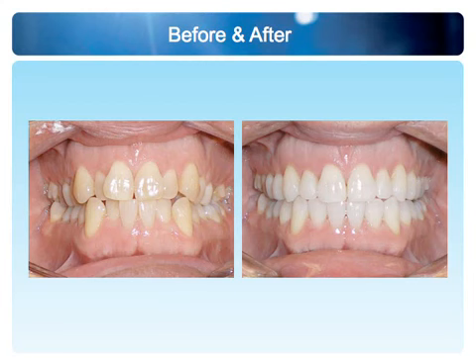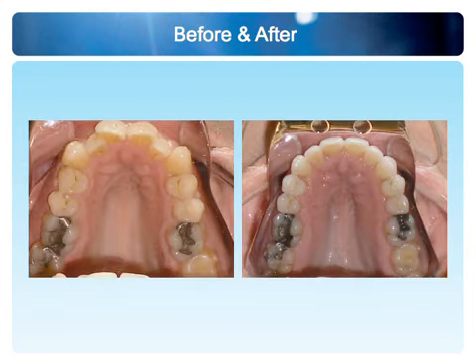What does the arch look like? Well, it looks like this. When we were finished with 28 aligners, which is a 14 months time frame, we have 32 millimeters between these teeth now. And so we have proper alignment of all these teeth, and upper laterals go to position beautifully, and a little bleach gel goes a long way. Takes all the colour off there.